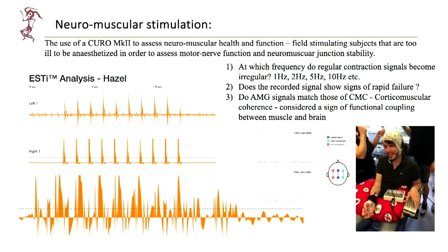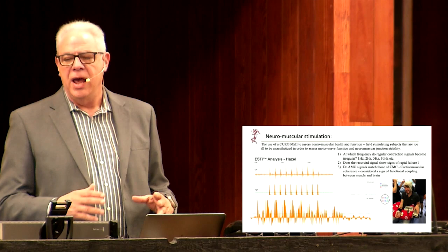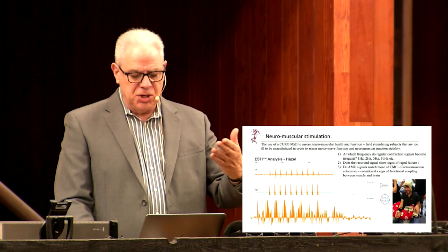We are actually identifying and measuring corticomuscular coherence, and what we're finding is that we are able to link up the acoustic myography signals from the muscle with those signals that are being measured in the brain, and there's coherence there. EMG doesn't give us that. So we believe that there's going to be a way to utilize acoustic myography in neuromuscular disorders across the board, not just myasthenia gravis, as an adjunct to earlier diagnosis of how the patient's neuromuscular dysfunction is progressing.